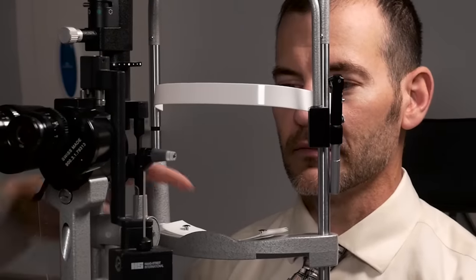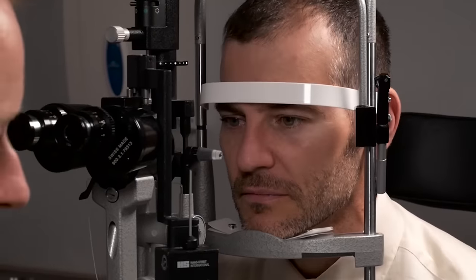Now when you place the contact lens on the patient's eye, be sure to give the contact lens a couple of minutes to settle down, especially if it's a toric lens. A toric lens has a tendency to orient in the correct position, but it takes a few minutes for the patient's natural blinks to put it in the correct position. In this case, we've given the patient a good solid five minutes to let the contact lens settle down. At this point, I'm going to pull the slit lamp over here and take a close-up look at the lens to make sure it's fitting properly. Come on forward, put your chin down there and your forehead resting forward.